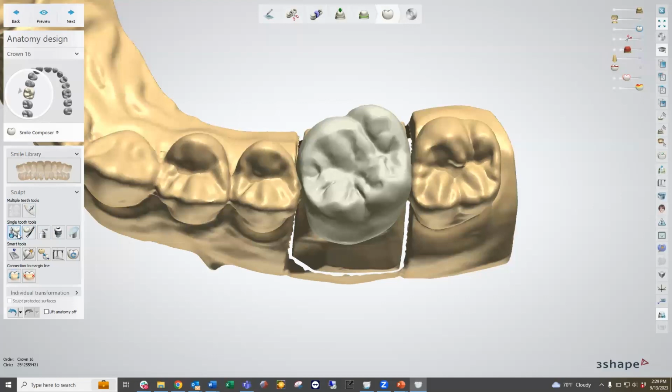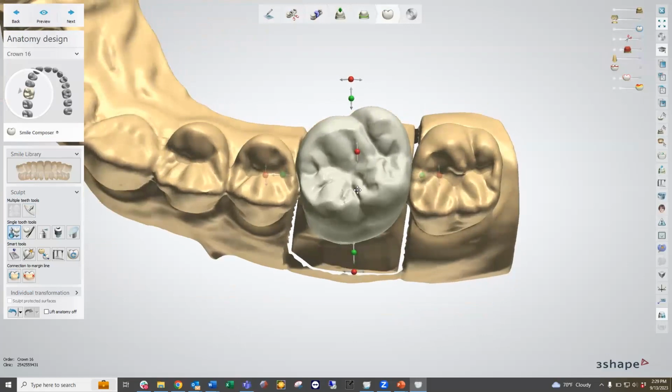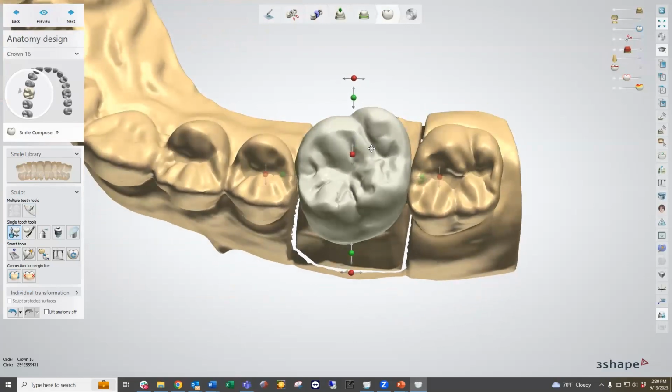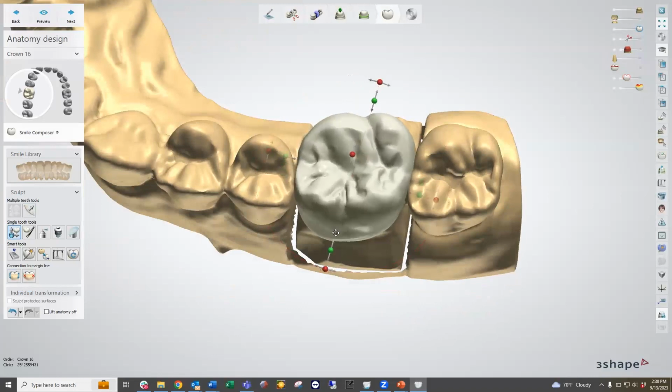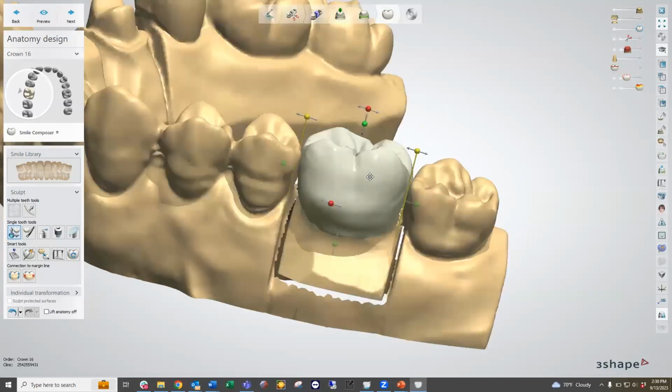The individual transformation tool allows us to grab the unit with individual handles, or dots. Those dots have different colors because they do different things. The red ones allow us to rotate, so I like to keep in mind R, red, rotate. The green allows us to scale that individual side, so I can drag out the buccal or suck it in a little bit. If the lingual is a little too far, I can pull that in as well. If I wanted to drag just the marginal ridge and not the whole side, green drags the whole side, while the yellow will grab just that marginal ridge.